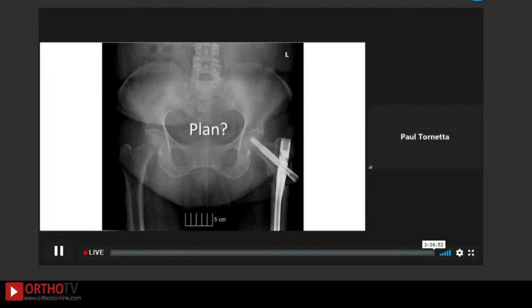So it's an atypical femur fracture, you can see that beaking. And I'm assuming that when you do full-length films, correcting the varus into valgus will get your length back. And Hassan will tell us if that's incorrect, because you do that assessment, of course. But these are ones that are almost non-unions when they start, right? Because they have such poor osteoclastic function.